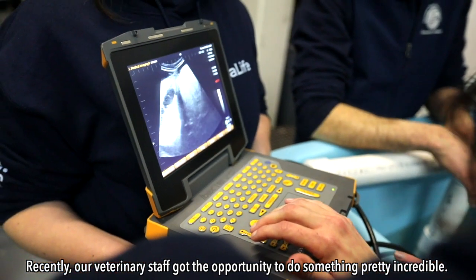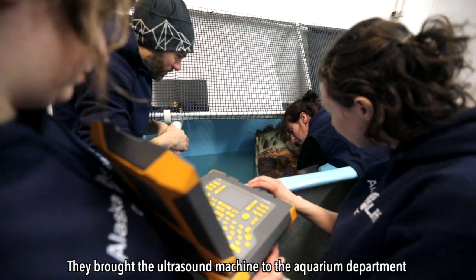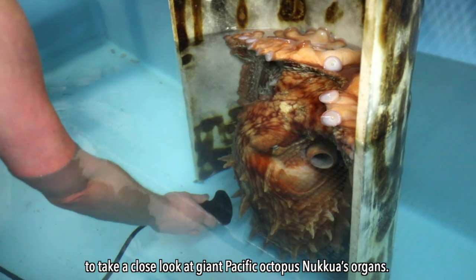Recently, our veterinary staff got the opportunity to do something pretty incredible. They brought the ultrasound machine to the aquarium department to take a close look at giant Pacific octopus Nukkua's organs.